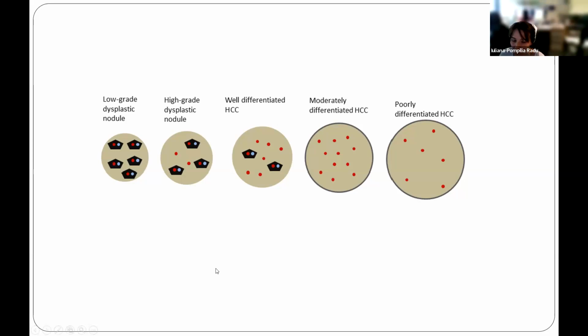In cholangiocarcinoma, we have a lot of fibrosis that is mainly in the center. This explains why it's not as strongly enhanced centrally, compared with the HCC. So we have an uptake of the contrast, but it is slightly less enhanced and there is a faster washout.